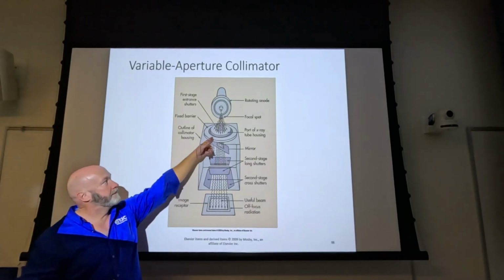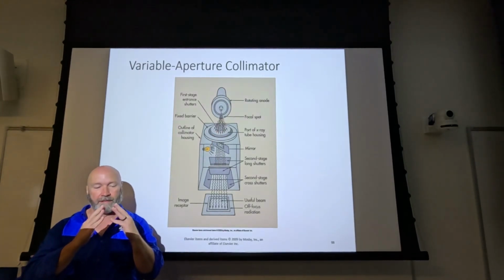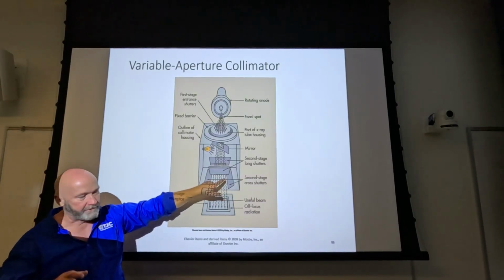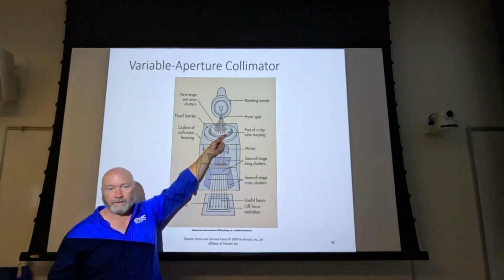And it's got big chunks of lead, and those pieces of lead will spread out so that you can open and close those. So when you open and close, you adjust your collimation, you're opening and closing those, but you're also opening and closing that as well.